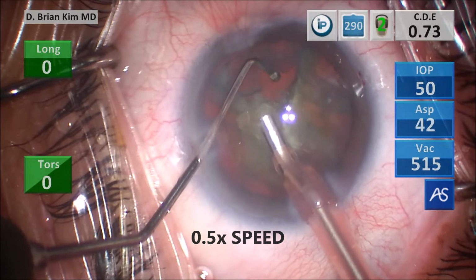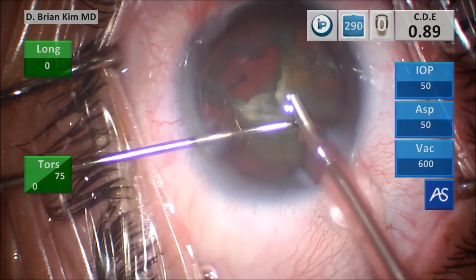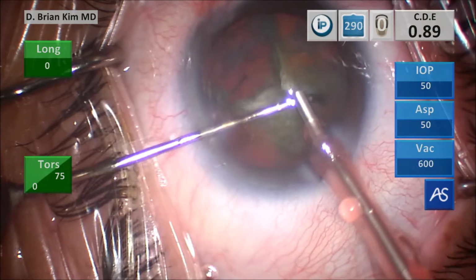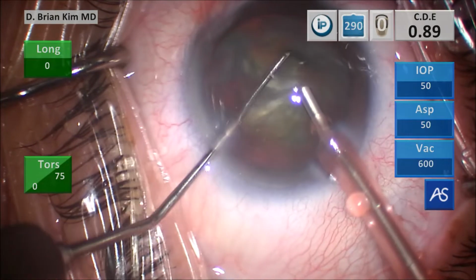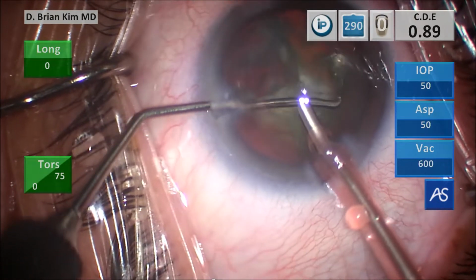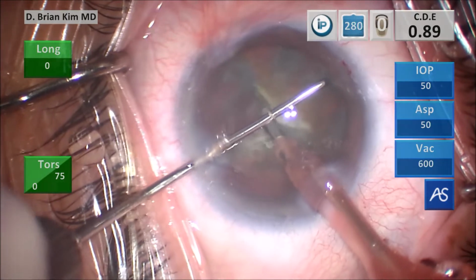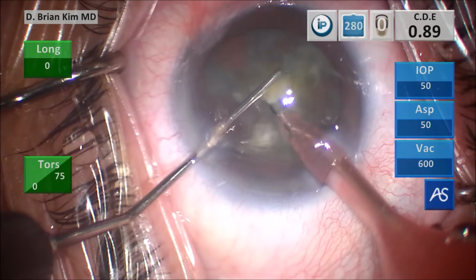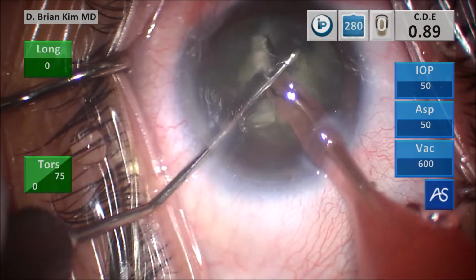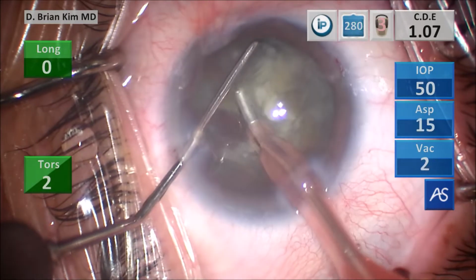Now turning the second quadrant in front of me, placing the chopper around the lens between the second quadrant and the rest of the lens, positioning the instruments very carefully around the lens, again, separating that. Again, it's a very sticky lens. That's what I was trying to tell you before. Very sticky, doesn't want to come out of the bag, and that's why mechanical fracturing forces are so helpful when you're dealing with a sticky lens.